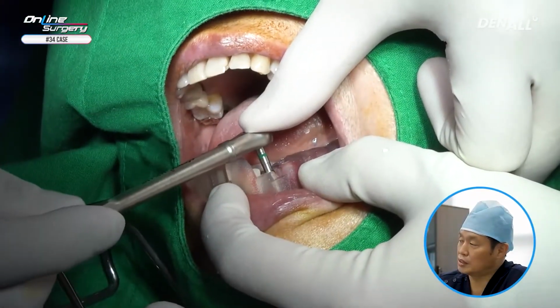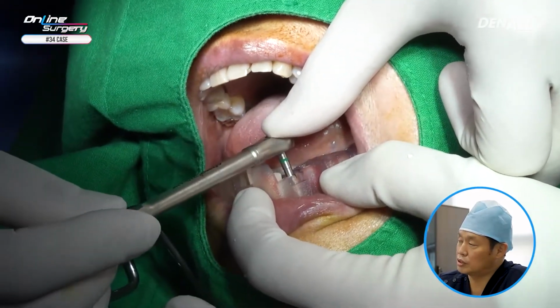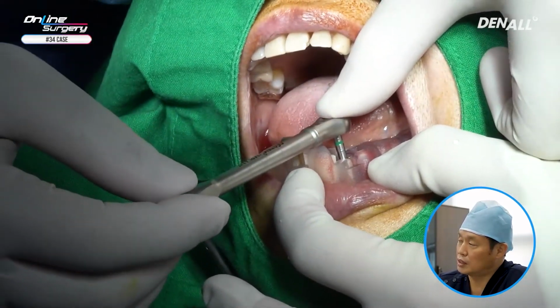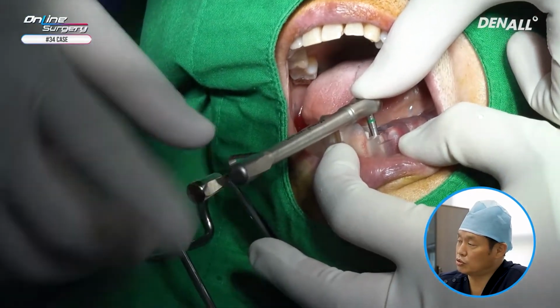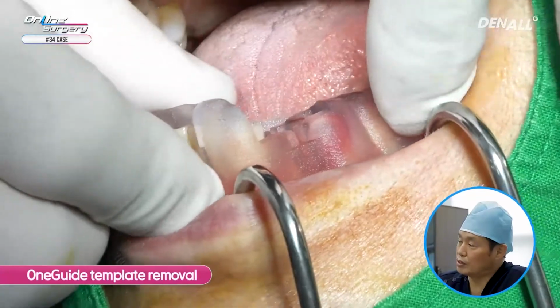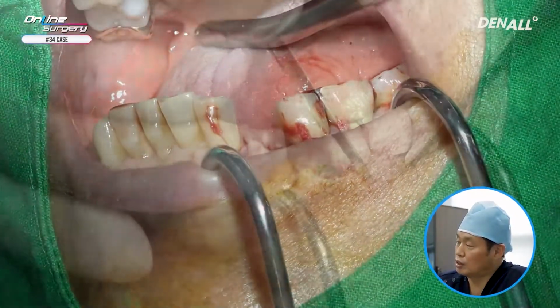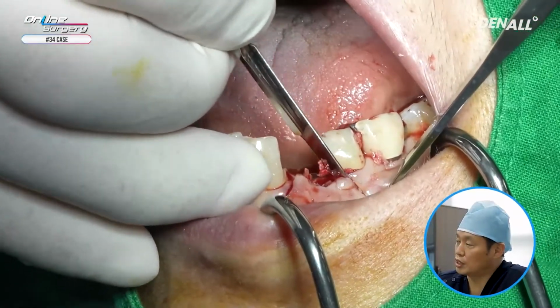Make sure that the template does not move. And I'm checking the final position of the implant. Primary stability is over 30 Newton centimeter. One guided template is removed. For GBR, the incision is going to be extended.